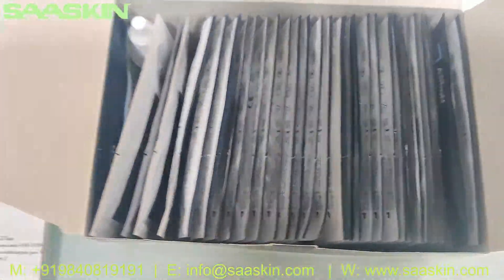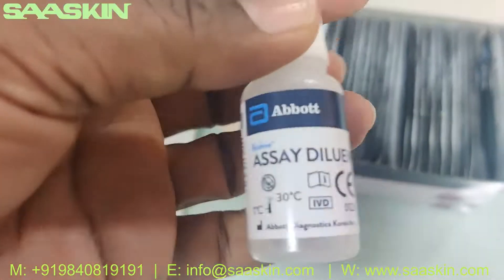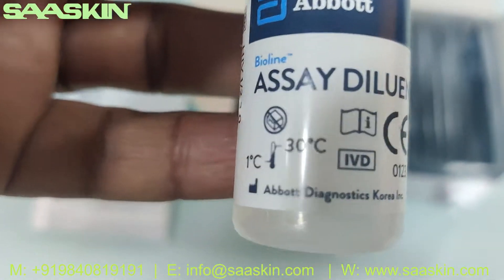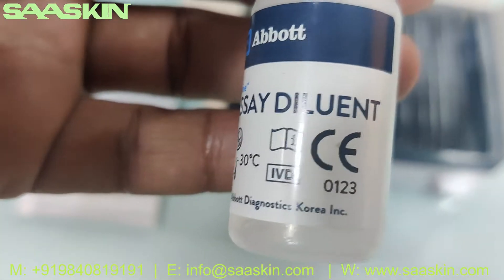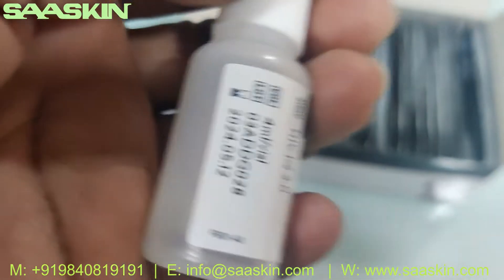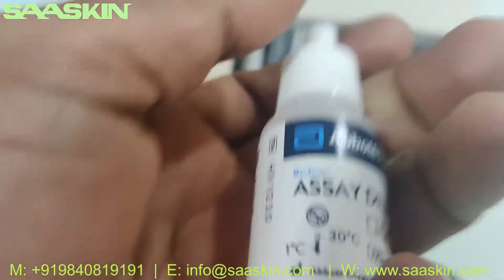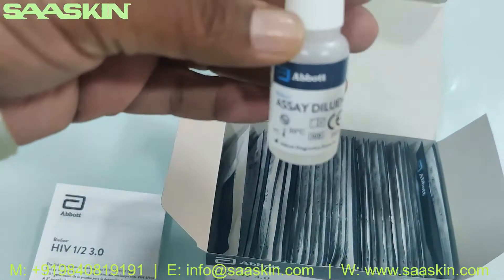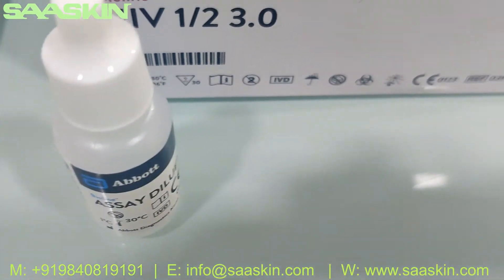Inside the box, this is a 30 test kit pack. You can see 30 test cassettes and also you have got an extraction Dilution Buffer liquid. This is a 4 ml bottle — this is what the bottle looks like.